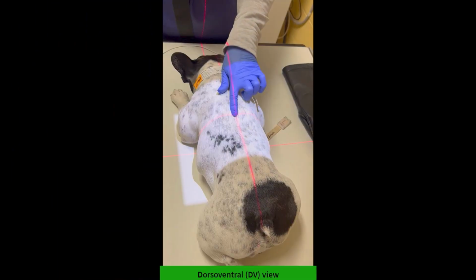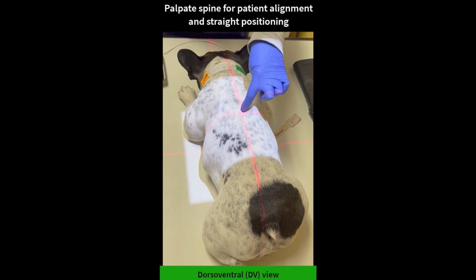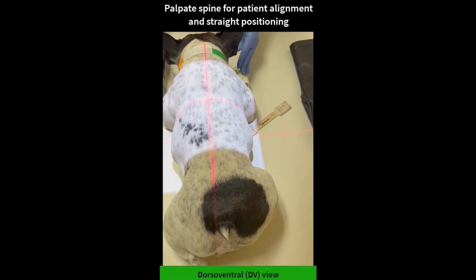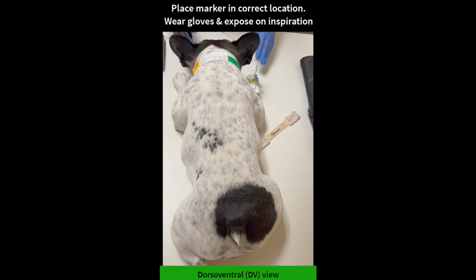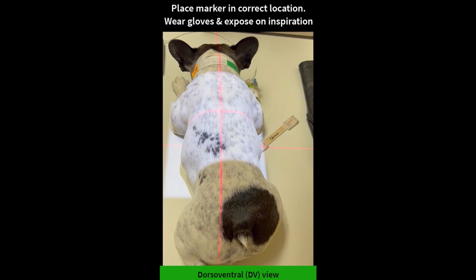Dorsoventral radiographs are obtained with the patient in sternal recumbency. The spinous processes are palpated and should align centrally with the longitudinal positioning line. The positioning marker should be placed. Radiographic technique factors are identical to those selected for a ventrodorsal view. Staff involved in patient restraint should wear appropriate protective equipment, including gloves.